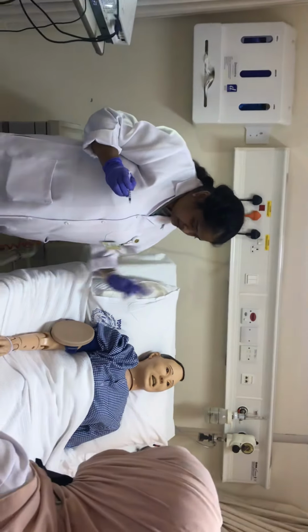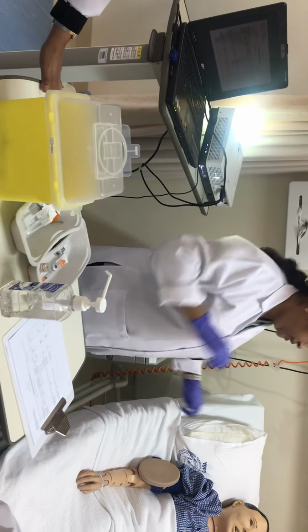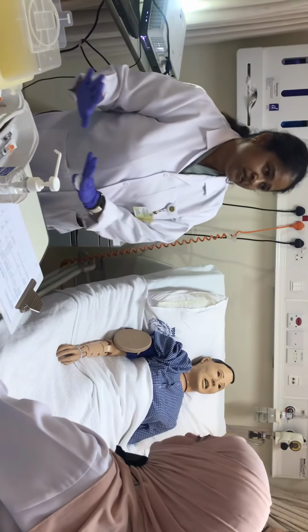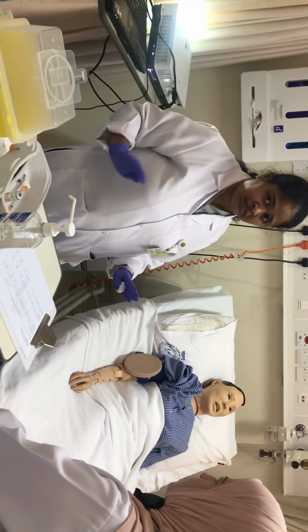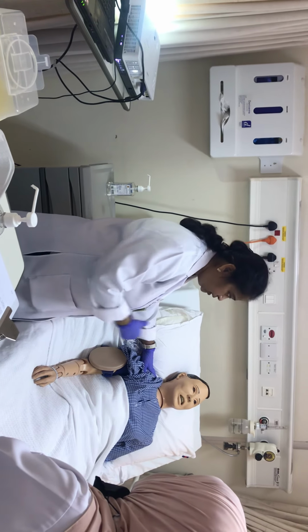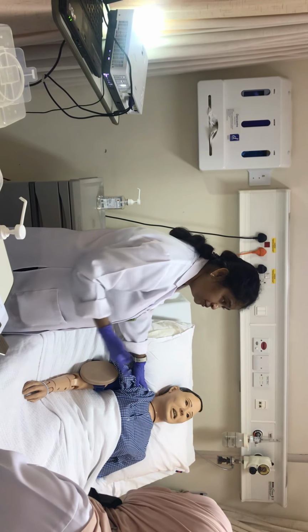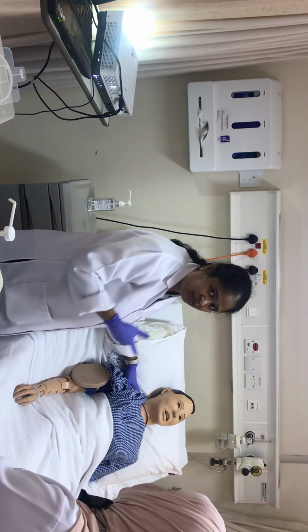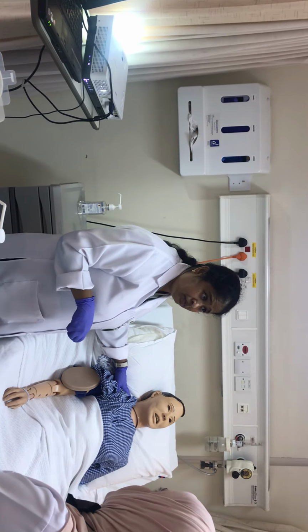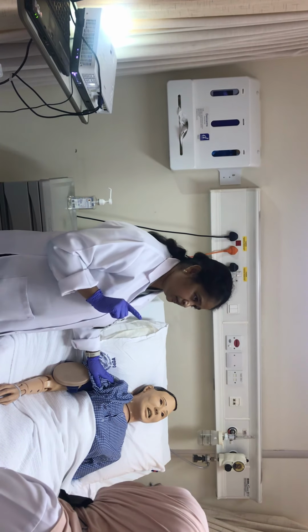Got it? So once they finish, immediately the first thing is throwing this. Second thing is putting the side rail and putting the patient properly. Then only replacing all their things. Okay, let them follow the steps correctly. So, okay, sir, are you alright? We have given the insulin. I want you to take your food now. If you don't take, you can have low sugar and you can say the symptoms. Dizziness you will have, sweating will be there, or after some time I will come back to you. If you have any problems, you can inform me. These things are all very important in insulin administration.